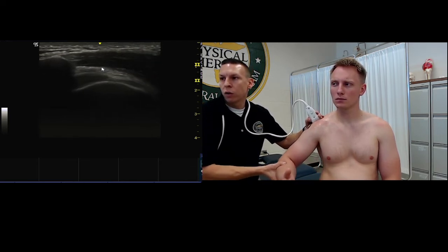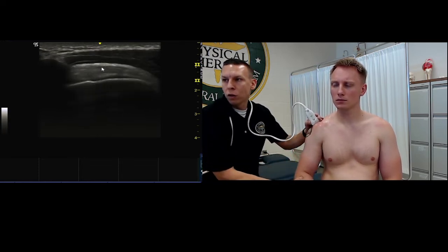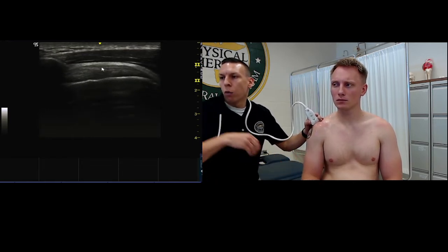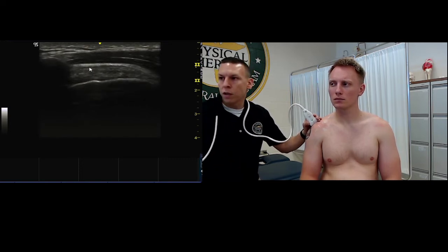And I would tell you, what I do is make sure you move them. Don't let them move themselves for most of the extent, so you can control that movement. And we're just looking for any kind of fluid bunching up or accumulated there. And so that's just a dynamic shoulder abduction motion.